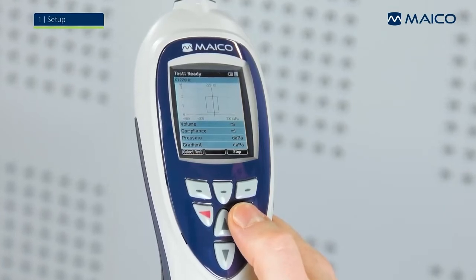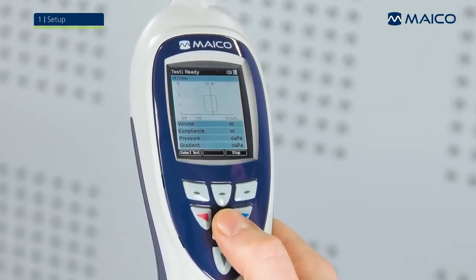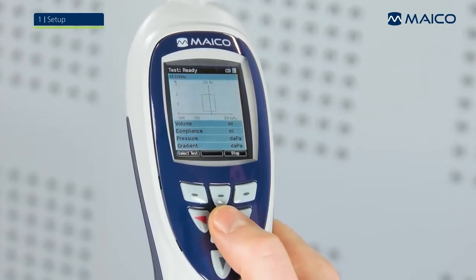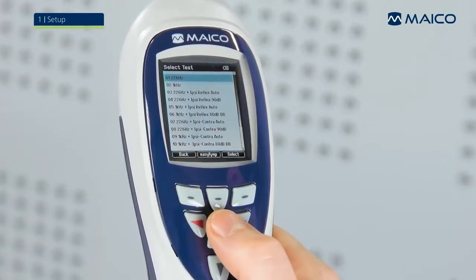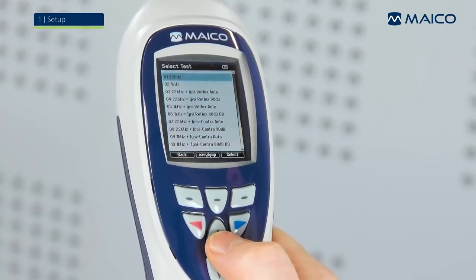Operating the easyTymp is very intuitive. It will start in the test screen with the last used protocol. To select a different test, use the left top button to move to the Select Test screen for protocol selection.